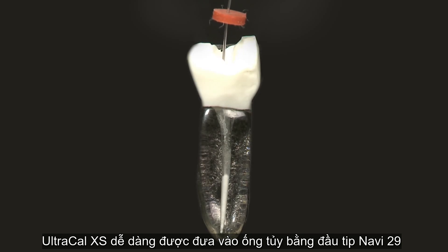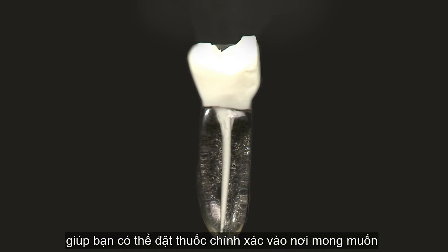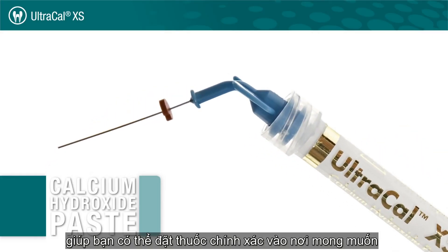UltraCalXS is formulated so it can be delivered using the 29-gauge NaviTip delivery tip. This means you can precisely place UltraCalXS just where it is needed.